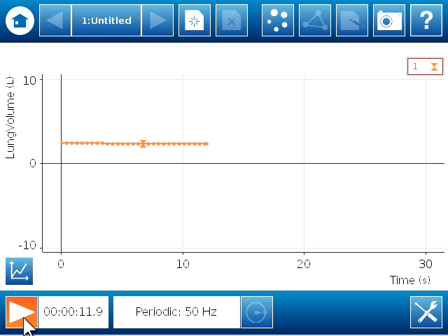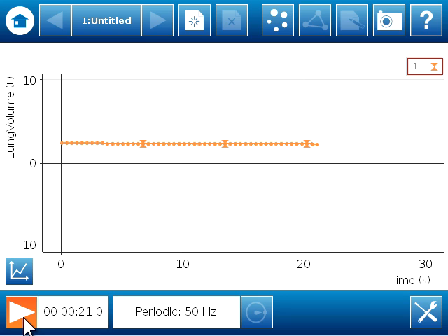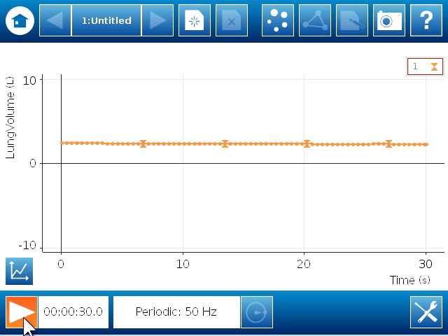And then shortly after that, the green light will blink and it says ready. So when it says ready, I can pick up the spirometer, and I can hold the tapered end of the mouthpiece in my mouth, kind of holding it between my teeth and letting my lips form a seal around the spirometer. And I'm going to just take normal breaths, making sure I breathe only through my mouth and not through my nose.